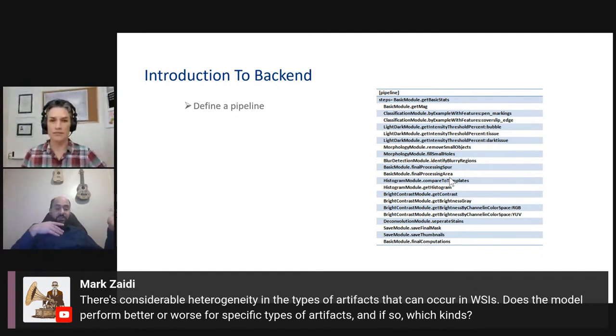In fact, we've done some other work. I mentioned DICOM. It took me maybe 2 hours to make a DICOM version. Of course, that requires more Python experience, but it's really not as complex as it sounds, because we only load the image in one specific place. So if you just change those 4 or 5 lines of code to use a different image reading library, then the rest of that pipeline will remain the same. It's not like you have to dig around and make a lot of changes. It's really very localized in one specific place.